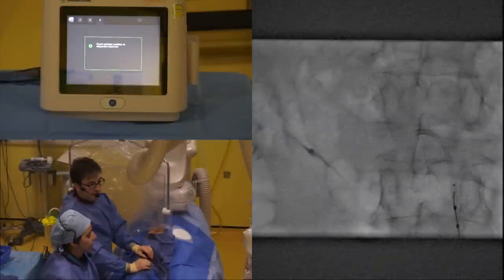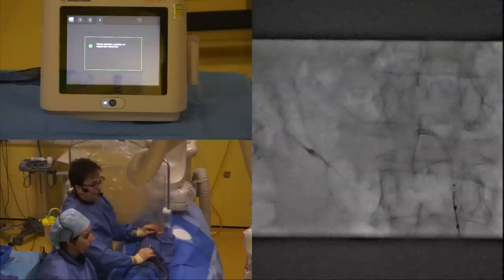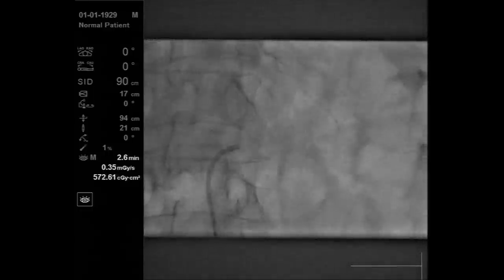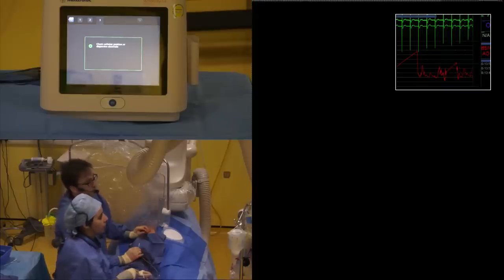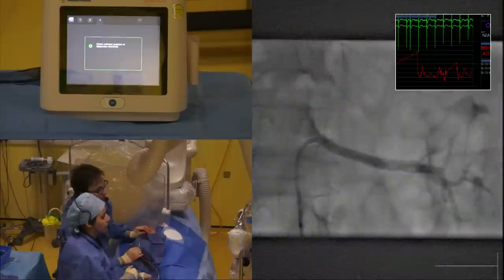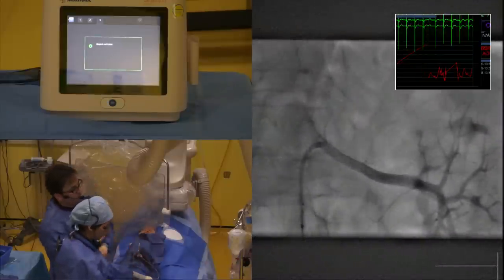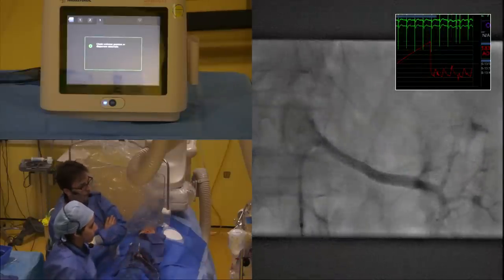Richard, could we go to the aortogram, please? It looks higher, isn't it? It is higher. I think you're right. Try that. I think you're there, aren't we? Yeah, there we go. Perfect. So, let's do a fluoro record, please, Richard. Okay, let's inject. Again, it's, hopefully, a relatively straightforward vessel. There's a little bit of disease, I think, in the proximal to mid portion of that vessel. I don't know what people think about that.